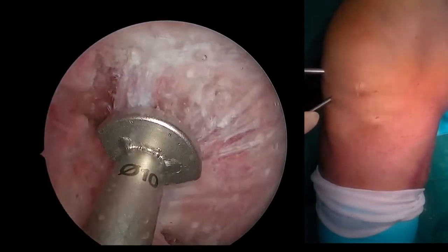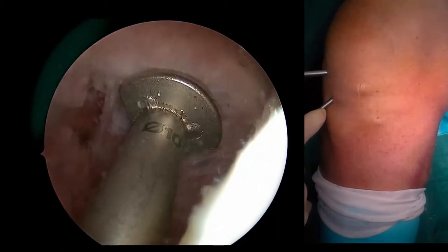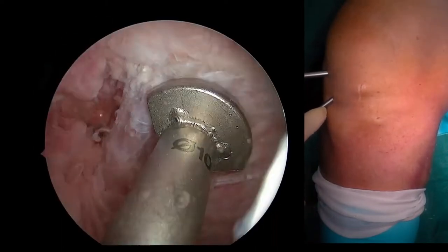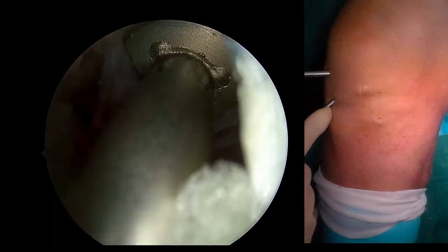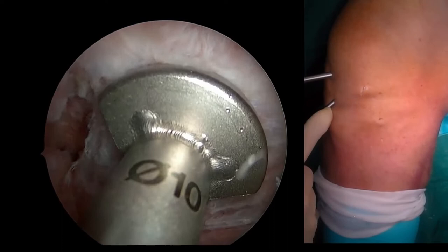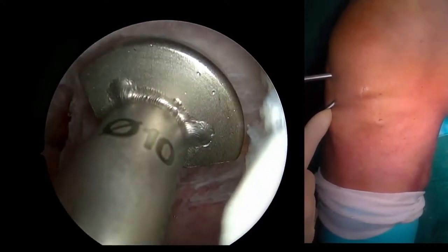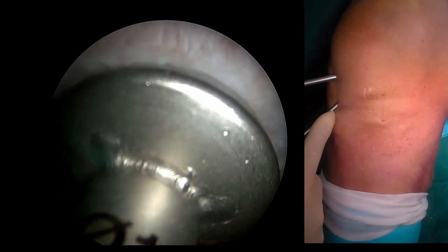Here we go. What I do is — I try to create this, imagine how the tines are gonna look like, so I put it in the edge of the cartilage right here. I just need somebody to drill the wire, which helps me to establish my tunnel. There's nothing that can go wrong, just drill it all the way through, out of the lateral cortex.